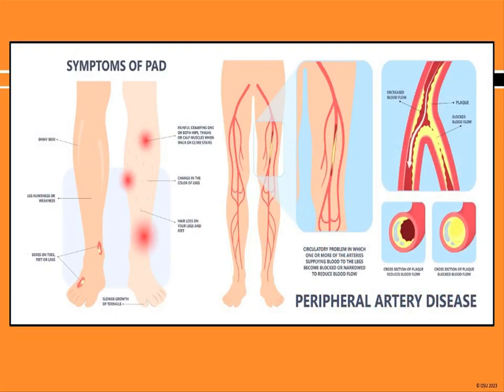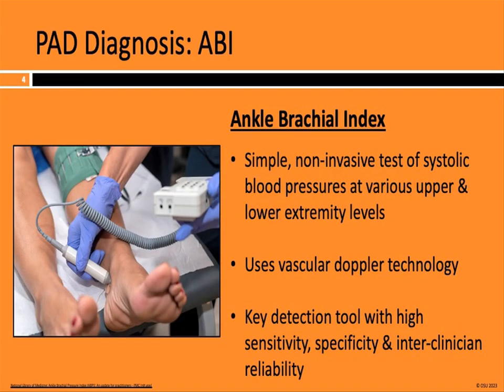First, a brief overview of the pathophysiology of peripheral artery disease. A blood vessel that is patent, open without any occlusions or atherosclerosis, allows for blood to flow easily. Over time, atherosclerosis develops due to chronic inflammation and activation of the immune system within the arterial walls. Lipids deposit within this region over time, including the blood vessel. A stenotic femoral artery reduces blood flow to the lower extremity, thus causing peripheral artery disease. To assess the severity of peripheral artery disease, an ABI or ABPI ratio is calculated by measuring the ankle systolic and the brachial systolic blood pressures.